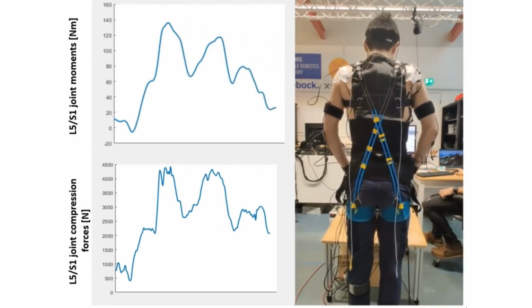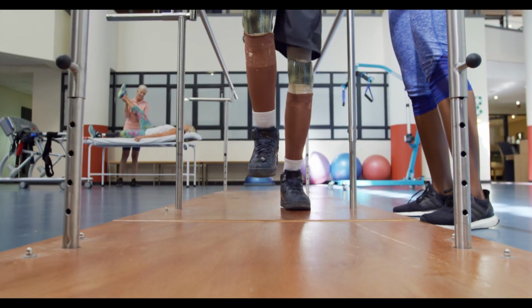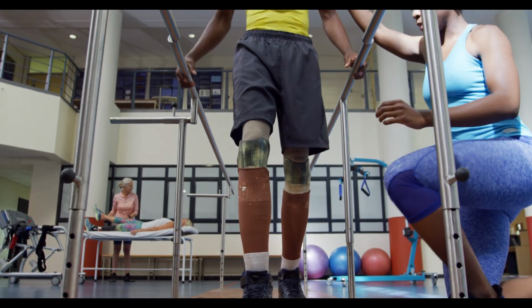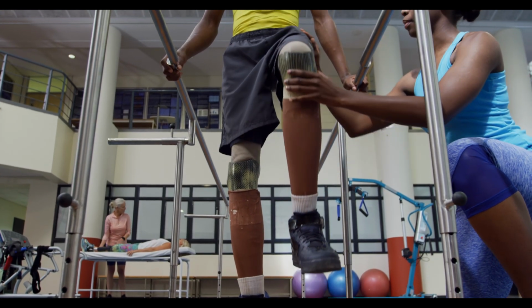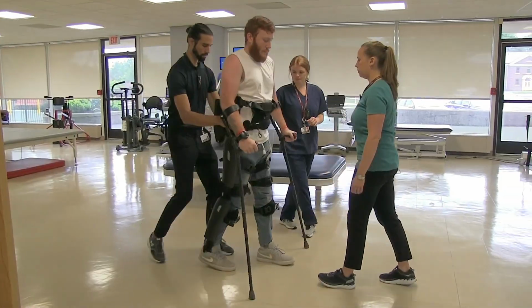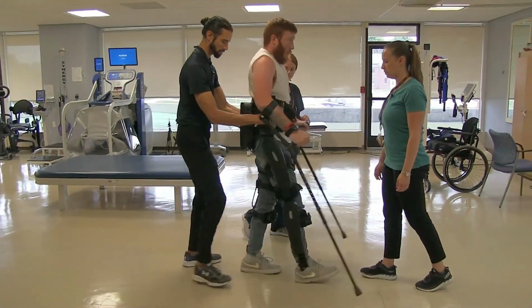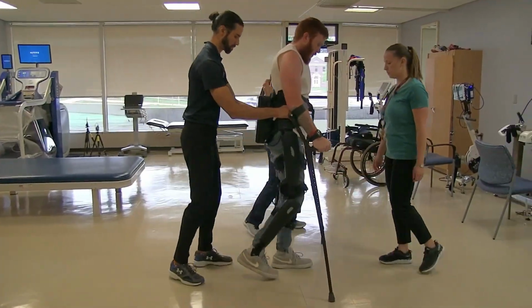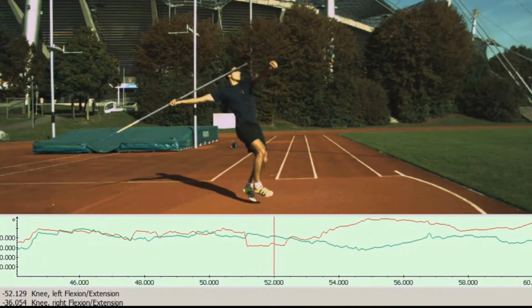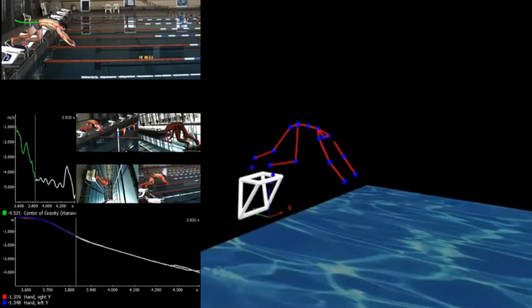The importance of CEINMS-RT lies not only in its technical breakthrough, but in how it provides a new interface for human-machine cooperation. In rehabilitation medicine, it enables real-time assessment of muscle recovery and adaptive adjustment of training assistance. In exoskeleton control, it serves as a physiological control core, allowing robots to interpret muscle signals and deliver assist-as-needed torque. In sports science, it can monitor athletes' muscle loads during motion, providing physiological insight for fatigue assessment and training optimization.